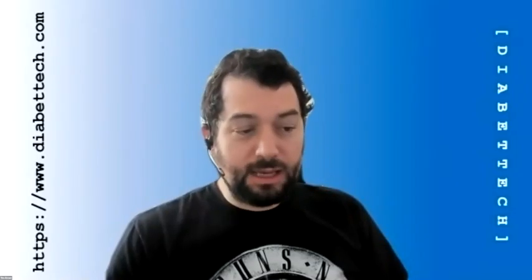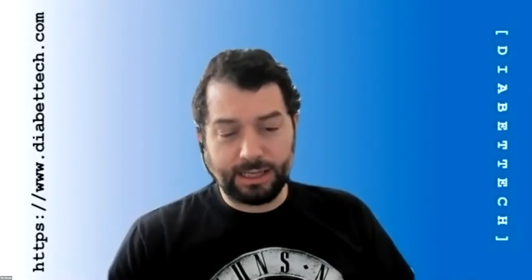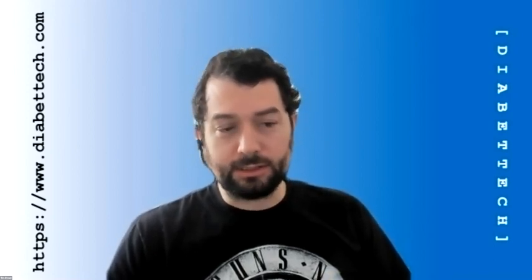Tim, it's Chris. Could I try another question? I read with great interest your recent 1 month trial with CAM APS. I also appreciate that it's not the cheapest solution out there. You're still using Android APS, so it didn't make you think that you wanted to switch then? So for me personally, the issue with CAM APS was, as much as anything, that the Dana RS I was using was a trial, and fortunately I could give it back because the sets were awful, and I just couldn't cope with the way the sets worked on me.